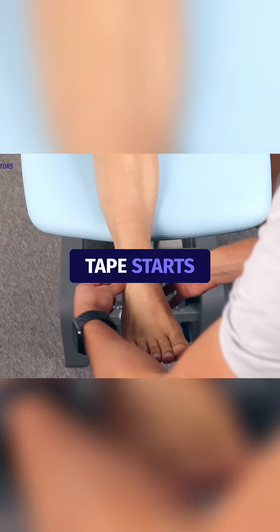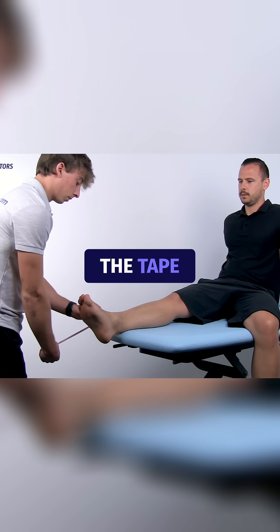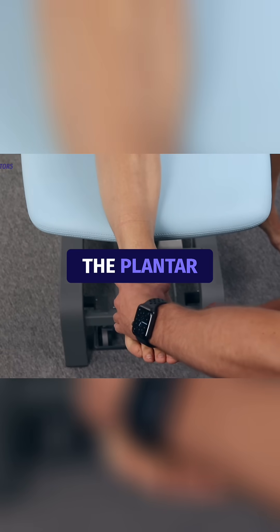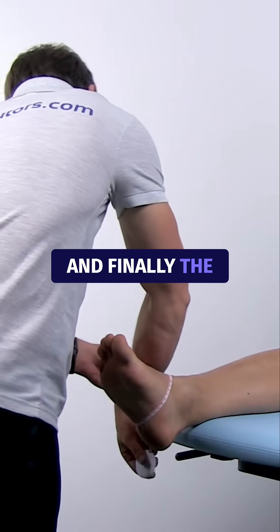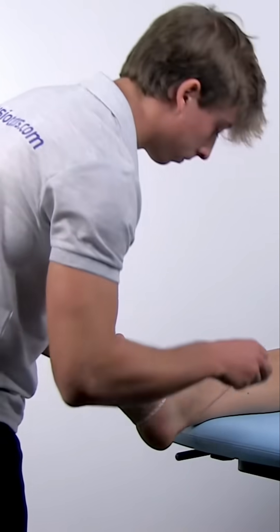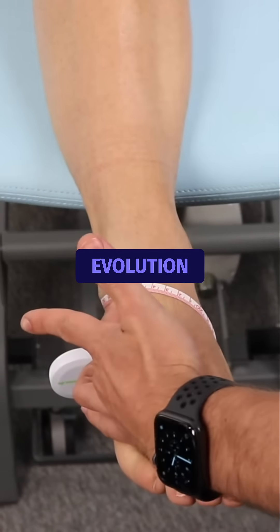The measuring tape starts between the anterior tibial tendon and the lateral malleolus. The tape measure is guided laterally under the foot to the medial arch, touching lightly the plantar surface of the foot towards the lateral malleolus, behind the Achilles tendon, and finally the medial malleolus, leading back to the starting point. The distance is then documented to track edema evolution.